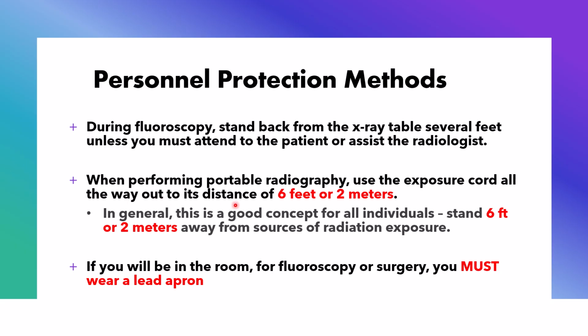In other words, we recommend, if you will notice on the portable machines, the exposure cord is 6 feet. You should use the entire 6 feet and be at least 6 feet away from the patient, and you should never be in the primary beam. And that primary beam is that radiation that's leaving the tube. In general, this is a good concept for all individuals. Stand 6 feet or 2 meters away from the source of radiation exposure.